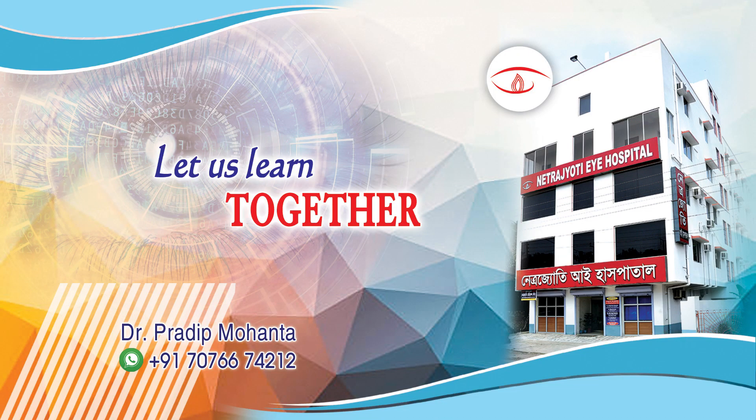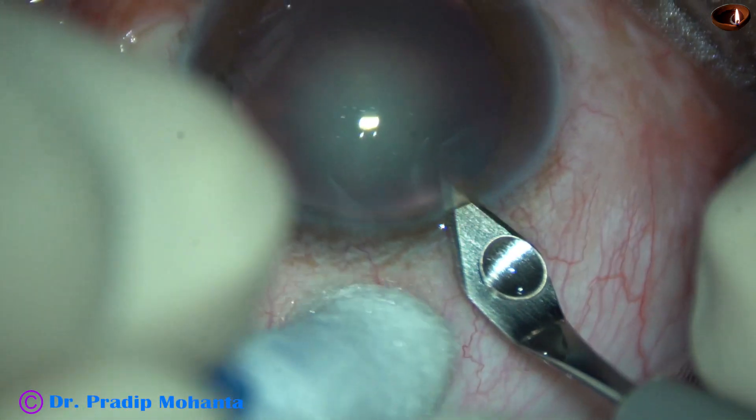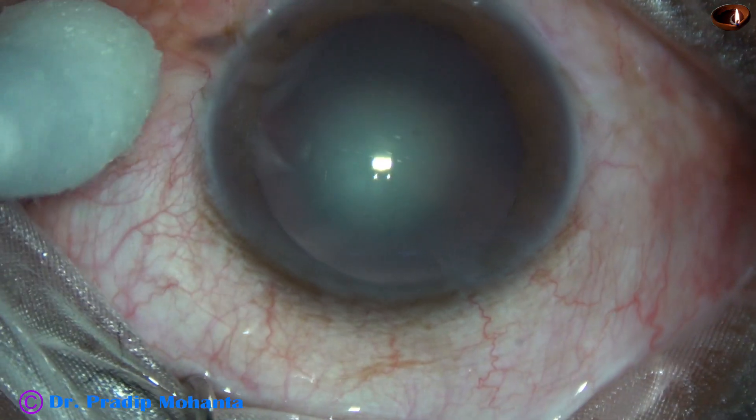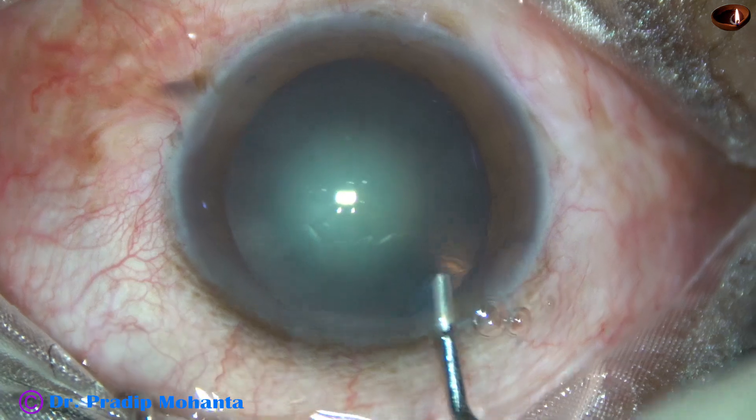Friends, welcome to my workplace at Ranaghat, West Bengal, India. Let us observe real-time management of this soft cataract. This is the main incision at mid-limbus with a 2.8 mm steel keratome.